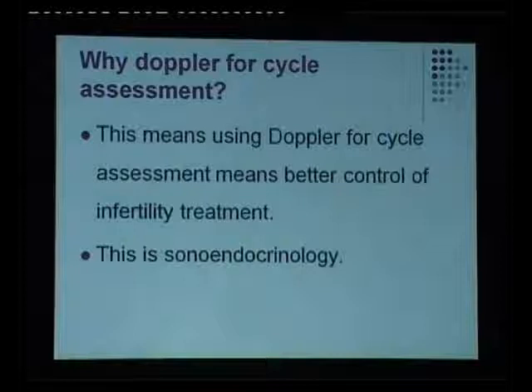Yeah, sure. That brings us to a conclusion that if the PSV of the follicle is more than 20 with a low RI on your pre-HCG scan, you need 2 IUIs instead of 1. The earlier IUI helps you to maintain your good pregnancy rates. The follicles with a more uniform perifollicular network are more likely to produce pregnancies, and therefore 3D power Dopplers are required.